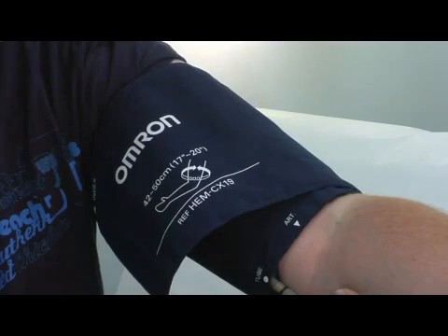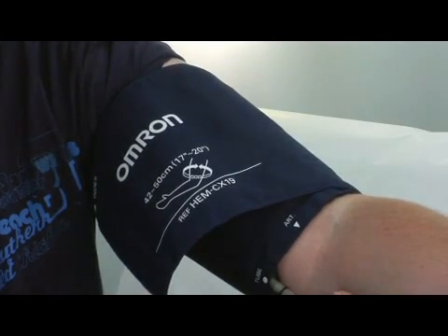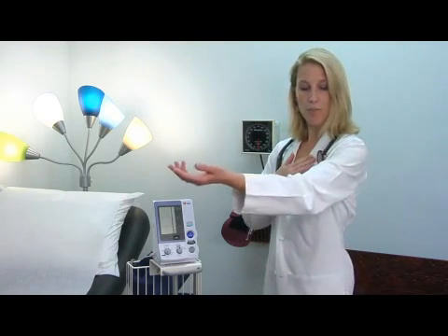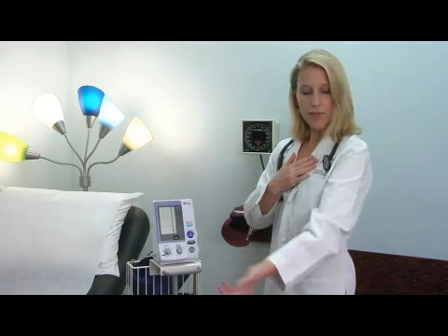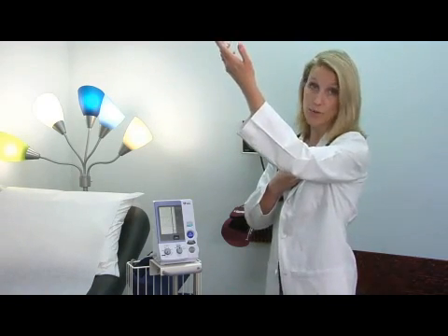You also need to be sure that the arm cuff fits you properly, because in particular, if the cuff is too small, you'll get a high reading. When you're getting a blood pressure reading, you also want to hold your arm at the level of your heart. If you're not sure where that is, think about the Pledge of Allegiance — lay your hand over your heart and then raise your other arm so they're equal. That's the position you want to be in. If your arm is lower, blood is running downstream and you'll get a high reading. Similarly, you can't raise the arm and cheat.